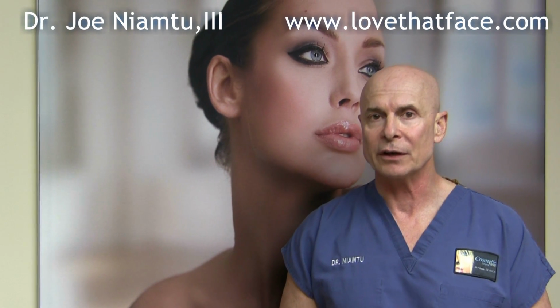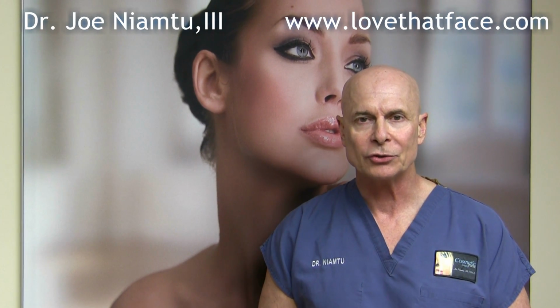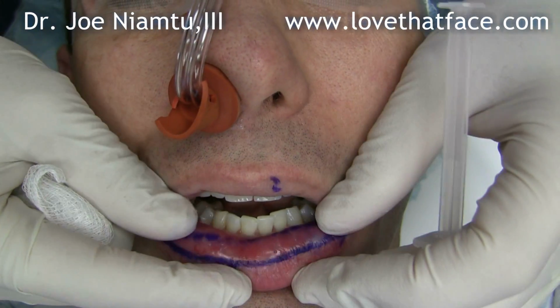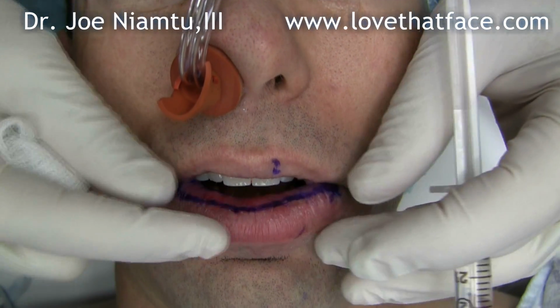So we're going to use the Lumenis CO2 laser, which is a completely bloodless procedure. So join us as we do a lip reduction on a Caucasian patient. We're doing a lip reduction on a Caucasian patient. We're just taking out about 5 millimeters or so of tissue.